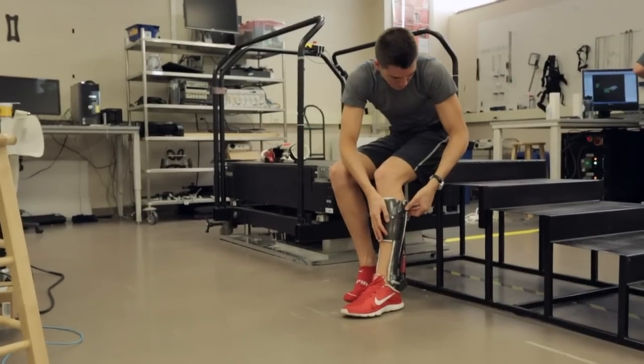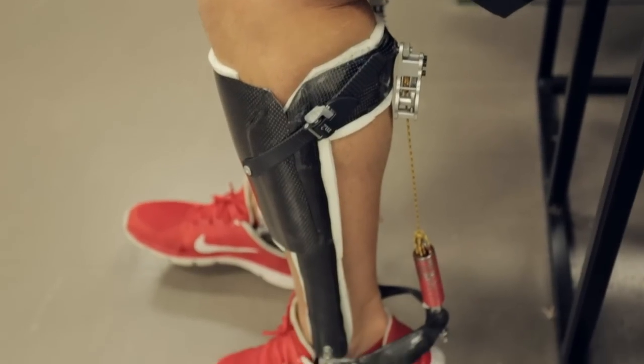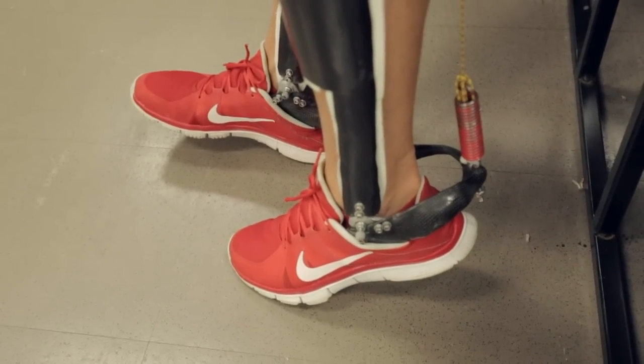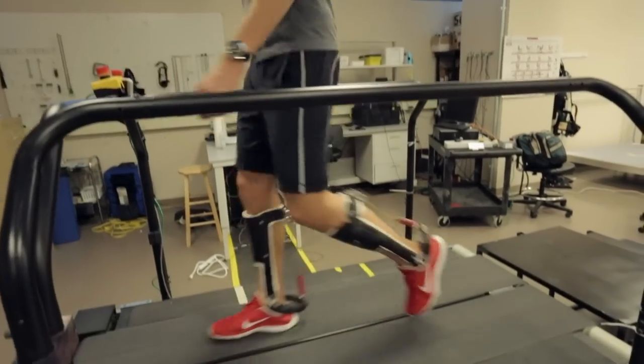So we had the idea to take that clutch spring — the Achilles tendon calf muscles — and copy-paste it outside the body in a mechanism worn as a carbon fiber skeletal structure, an exoskeleton, by transferring mechanical energy to and from the person strategically.